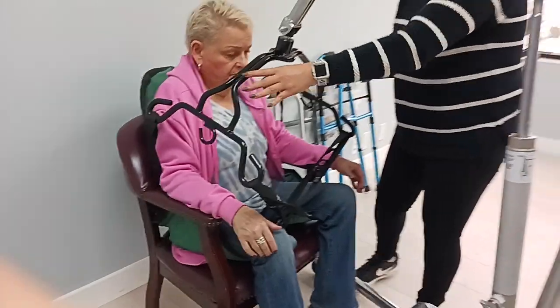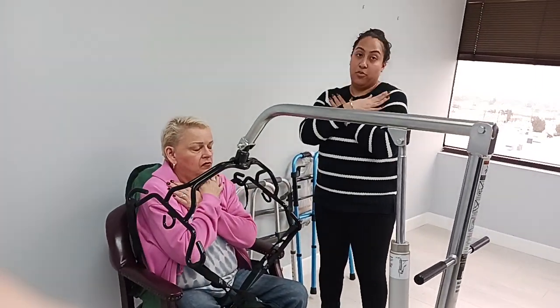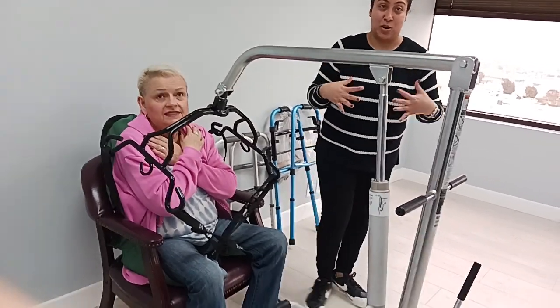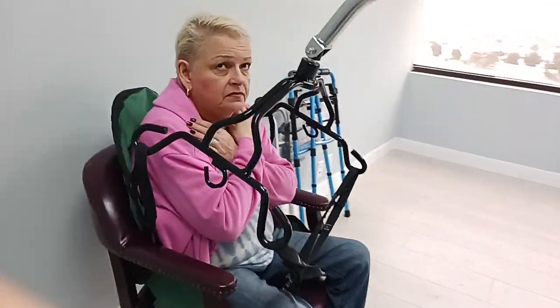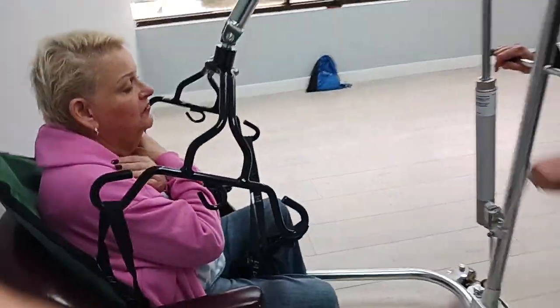So put it on. We have to make sure — Sandy, can you please make sure your hands are crossed? Basically your right hand and feet need to be inside. That's right. So that's for her safety. This is locked — not for her to say her prayers. She says it looks like she's flying something.